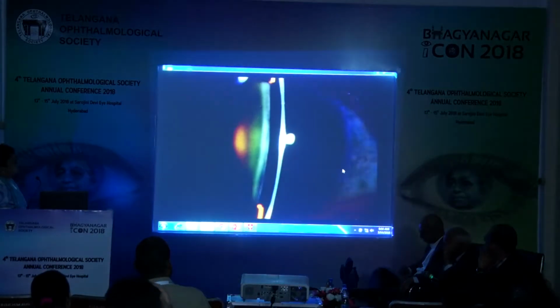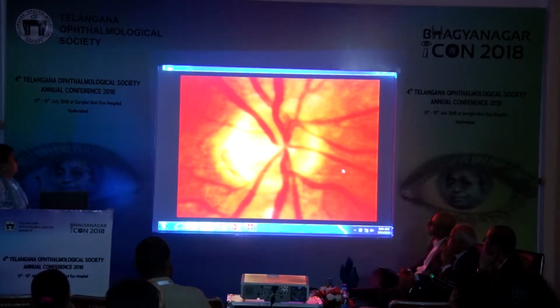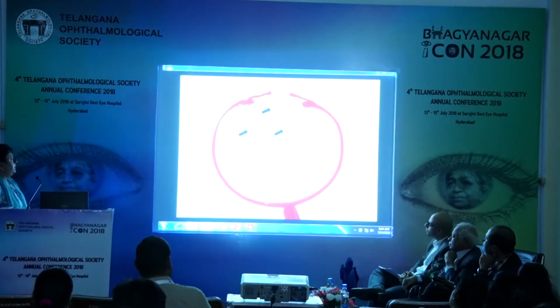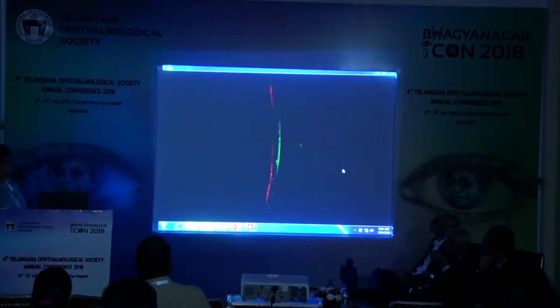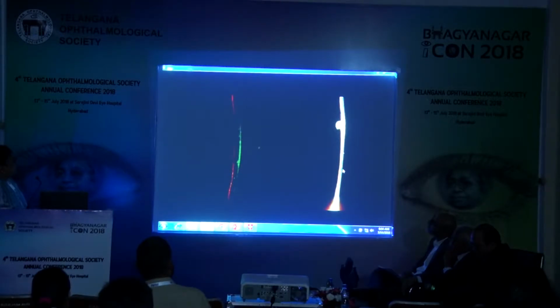Fellow left eye was shallow with a patent PI and cataract. Disc was normal. Diagnosis of recurrent aqueous misdirection was made in the left eye, and she had a YAG hyaloidotomy, following which the AC deepened marginally.